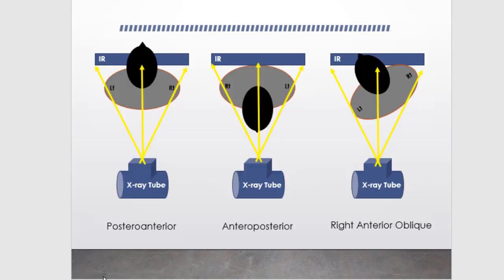Okay, for example, let's say you intended to do posterior-anterior. What do you mean by posterior-anterior? It's the pathway of X-ray entering the patient at the posterior aspect and exiting the patient at the anterior aspect, before reaching the cassette. This will be the condition of the patient standing, and we are looking at this patient from above the head.